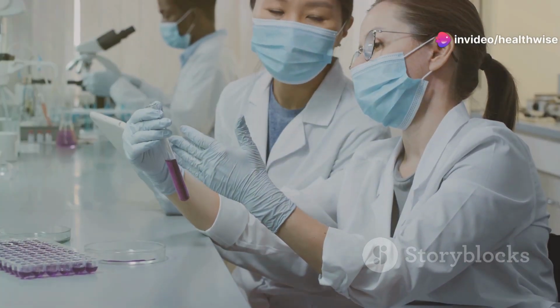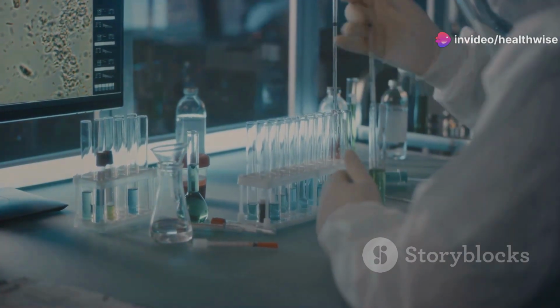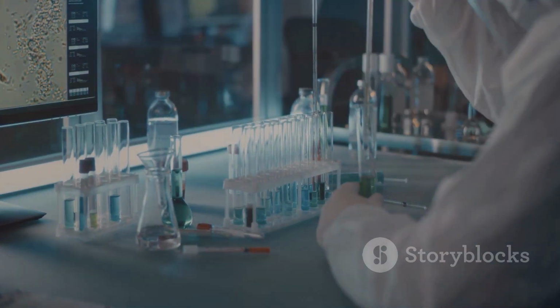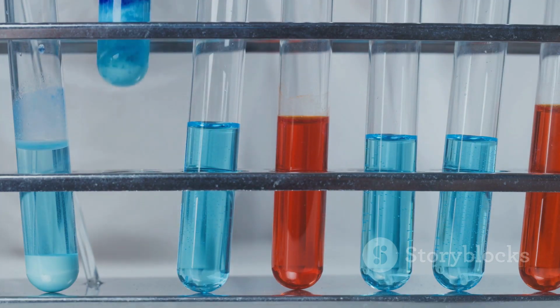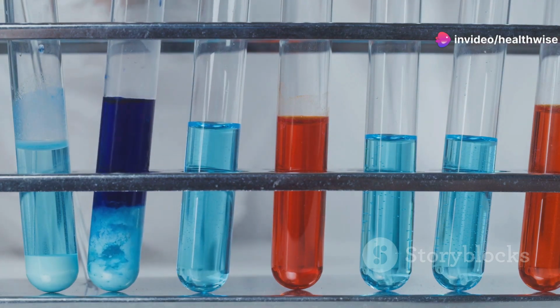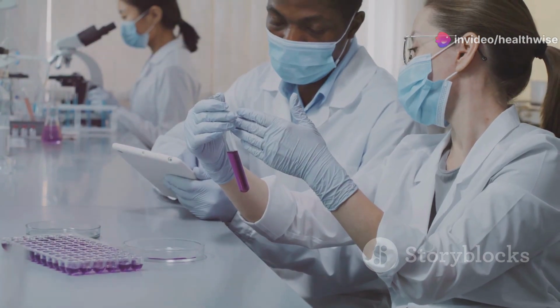Moving on to the sulfosalicylic acid test. Take 3 milliliters of 3% sulfosalicylic acid in a tube and add 1 milliliter of clear CSF. The cloudiness that forms is compared against a standard tube to estimate the protein concentration. Super easy, right? Now let's get a bit more complex with the Biuret method.